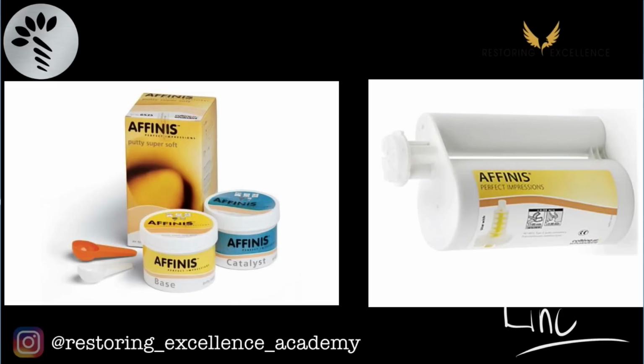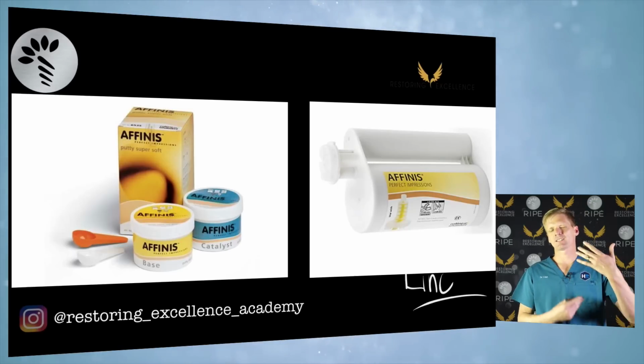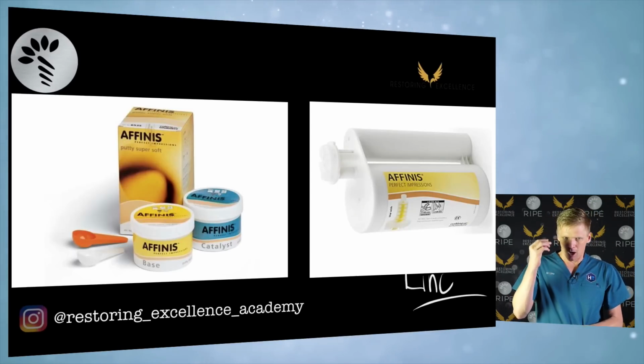Now, I'm showing you what I use here. I'm not going to tell you that you should all change to Coltene. I'm definitely not saying that at all. I think that the most important thing about your impression material is that you have a lot of experience with it and that you're used to seeing that particular material, how it reacts, how it sets, how fast it sets, and so on. I'm just showing you that I use it.